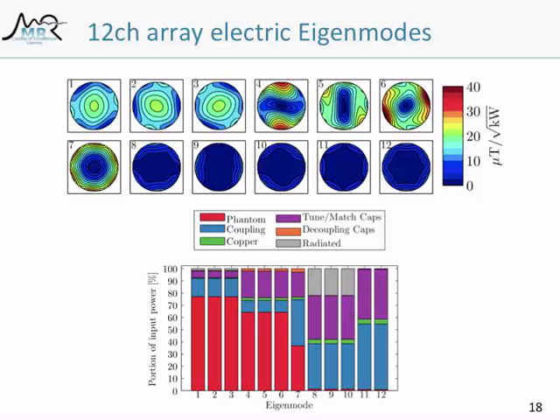And you can see that this octahedral coil has 3 homogeneous driving modes that you can use, and it's got 4 more modes that give sensitivity in the periphery, and the rest is basically nothing.